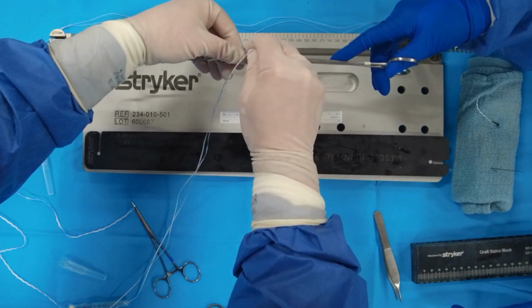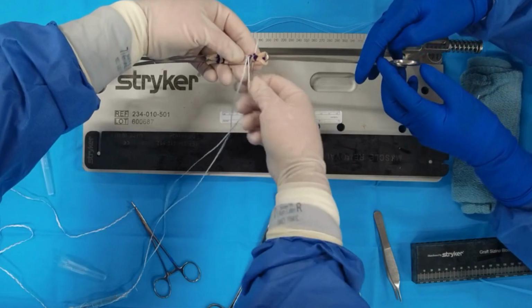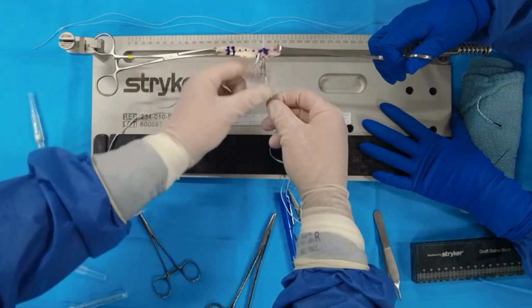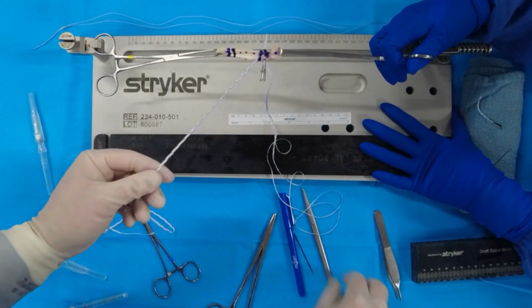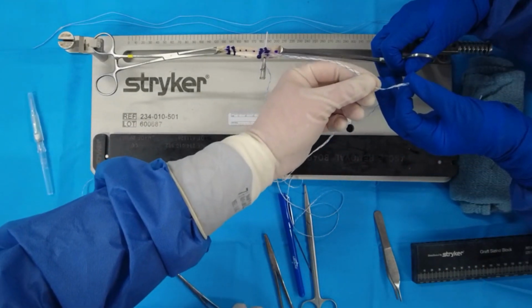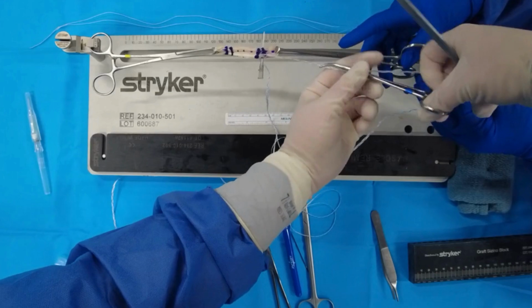Now, of course, if you're just going to use a typical looped suture, then you're going to start your loop at this point and start the whip as you normally would. But here we're going to first pop through with our tape suture, and then this is going to lay over top of the graft. And you can see we have a lot of excess. So you can put your hemostat on this just to make it easier for your assistant so they can hold both in the same hand at once. And then we're going to cut off the excess suture at the end of this.